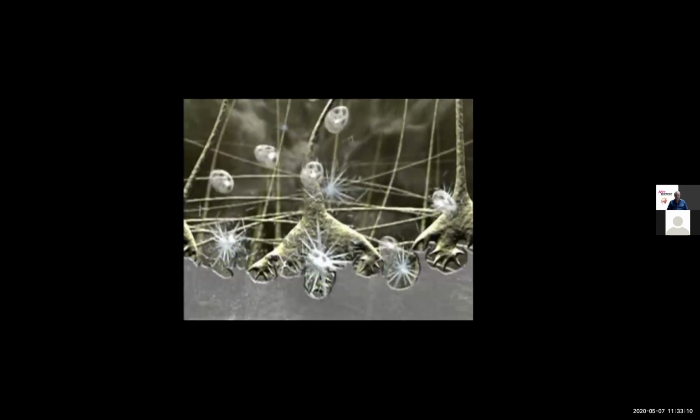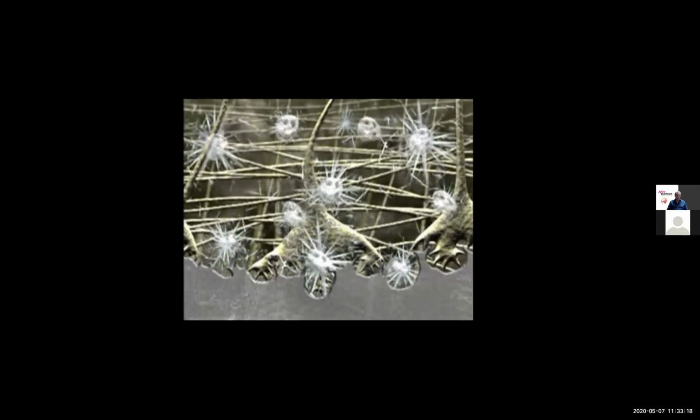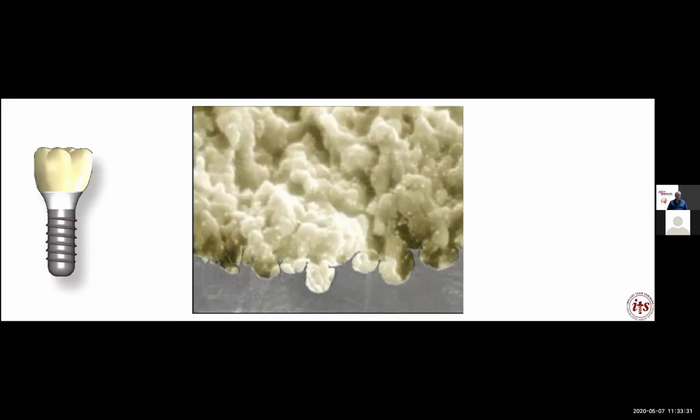Woven bone is the first type of bone that's going to be attached and developed around the implant, and this will change into lamellar bone under physiologic loading and mineralization of the woven bone. It should be mentioned that the mineralization process can take up to 4 to 6 months. So the interaction of the initial stability of the implant to bone is vitally important for long-term success.